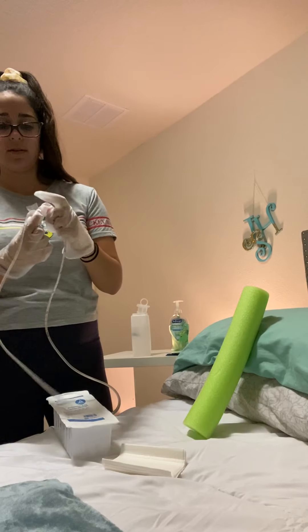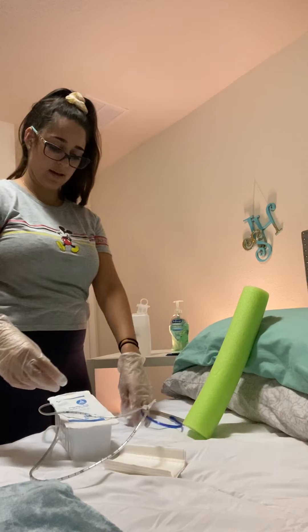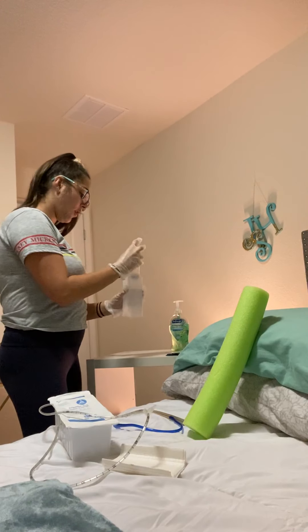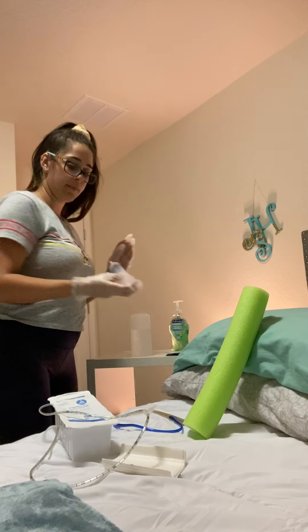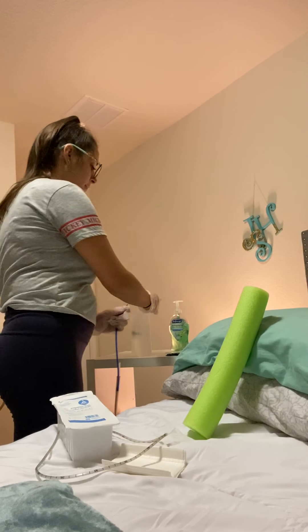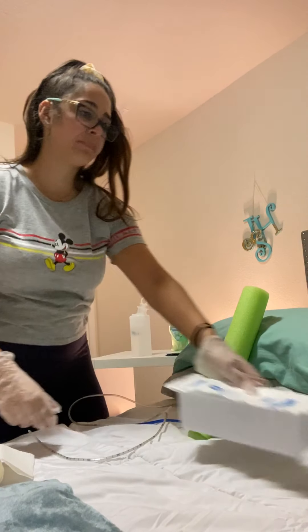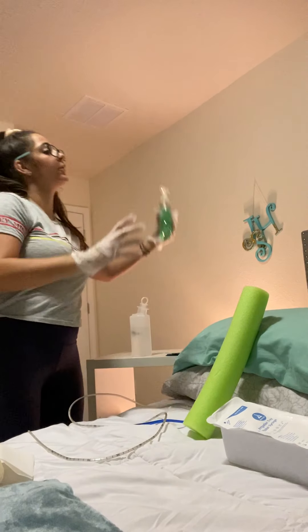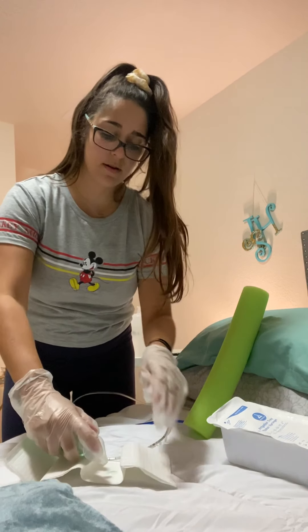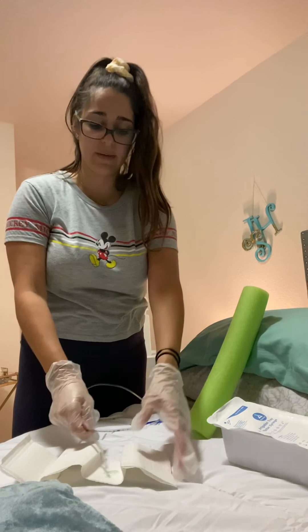Next I'm going to get my irrigation tab and 10 milliliters of water and insert that into my tubing. Then I'm going to get some lubricant and dip the tip of the tube into the lubricant.